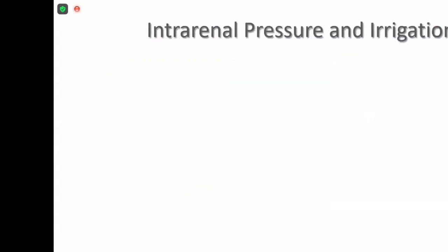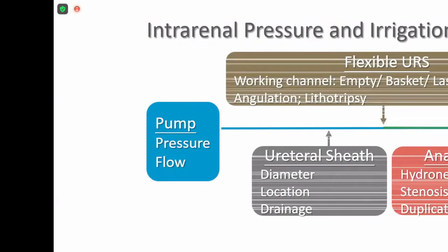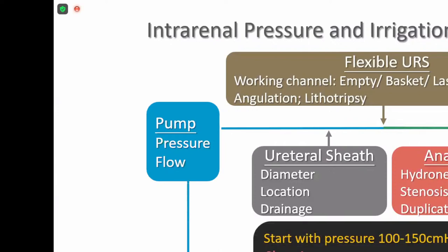And intrarenal pressure is affected by a lot of things: the pumping system, the pressure, the flow, the flexible scope type, whether the working channel is empty or you put in a basket or laser, angulation, or lithotripsy. And also the ureteral sheath and the patient's anatomy. So I just share my simple experience.